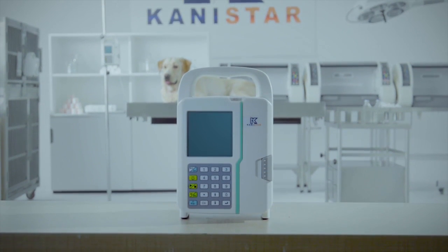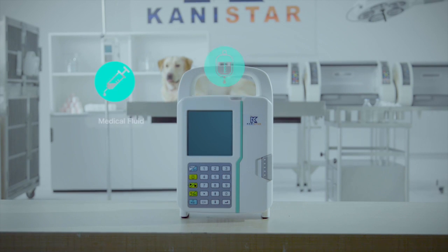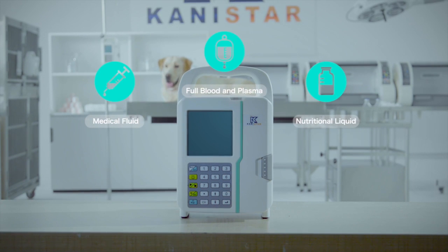With this unique feature, the LP1900 is a real three-in-one pump, capable of delivering medical fluid, full blood, plasma, and nutritional liquid.